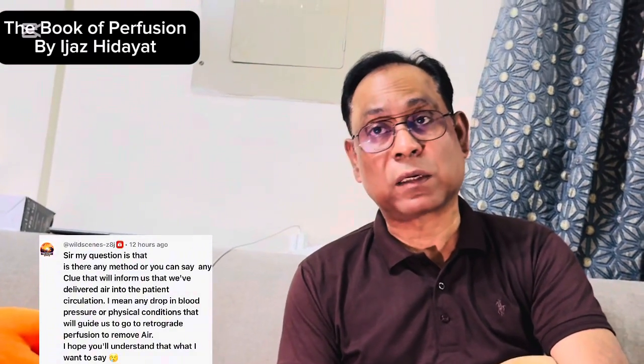So if you talk about cardiopulmonary bypass, how do you get a clue? Number one is physical appearance. The time you get the air, there will be bubbles. Usually you get air when your snugger is loosened, or somewhere there is a leakage in between. You can cut off some part of the atrium or IVC or SVC, whatever you cannulated, and you get air in through the venous line, and of course there's a chance of air lock, and you will hear the sound also. I'm talking about cardiopulmonary bypass, not the normal airs.